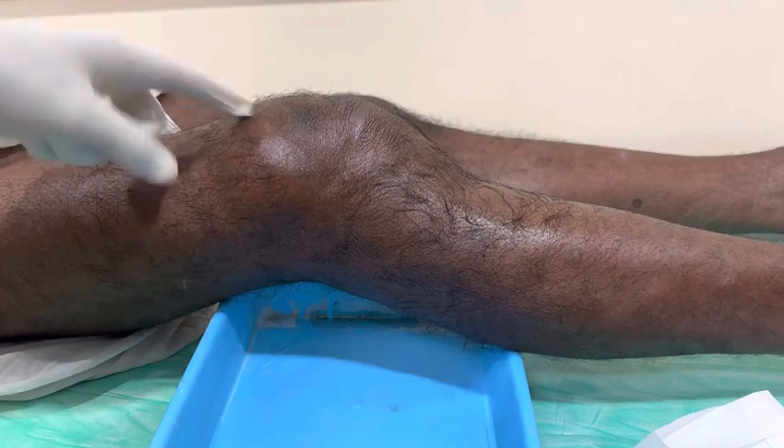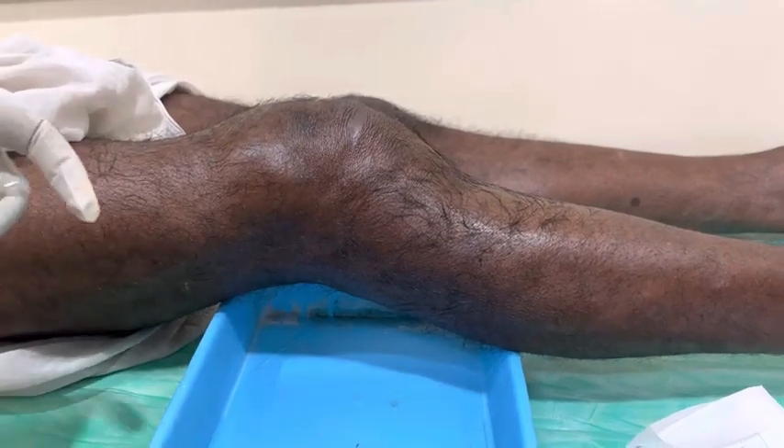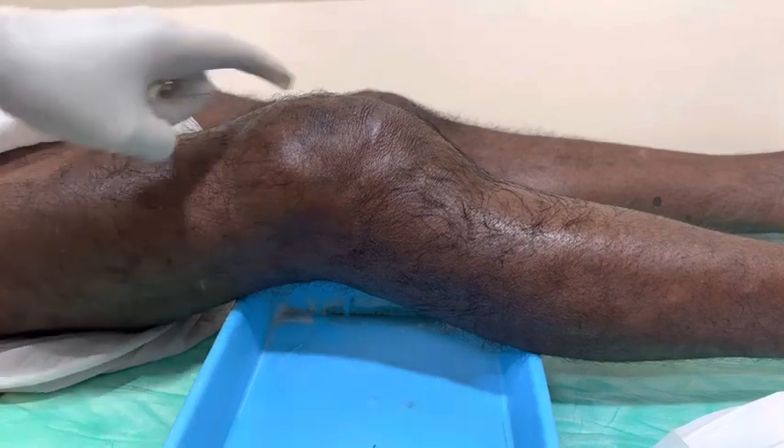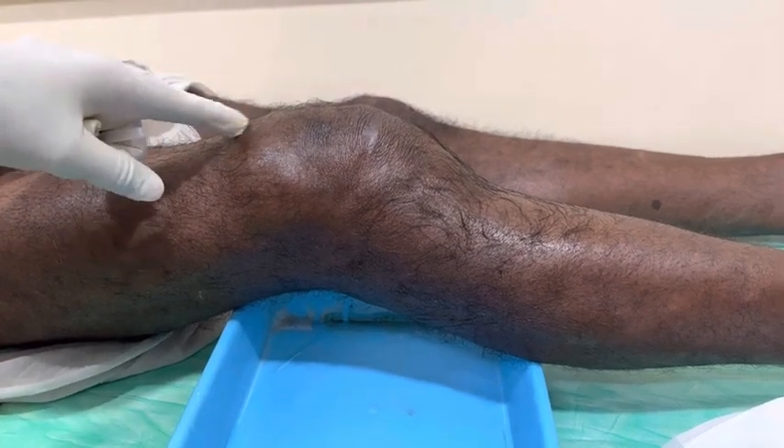This patient has been suffering from a knee injury and came in today with severe knee joint swelling, which you can see here. I'm planning a knee aspiration, which relieves knee pain instantly. After the aspiration, he will feel very comfortable. I'm now starting the procedure.